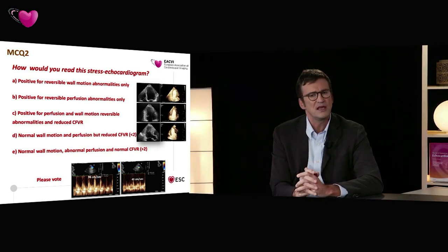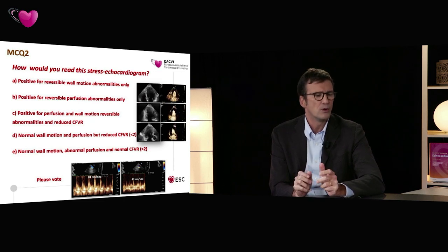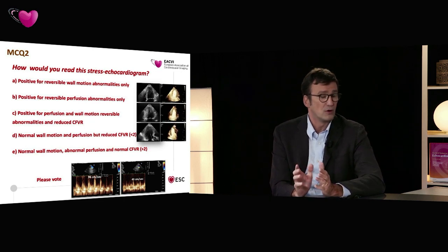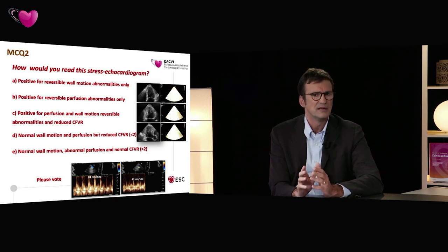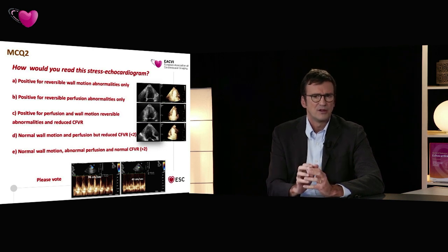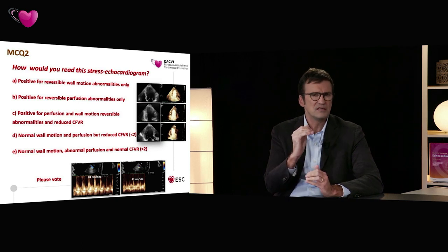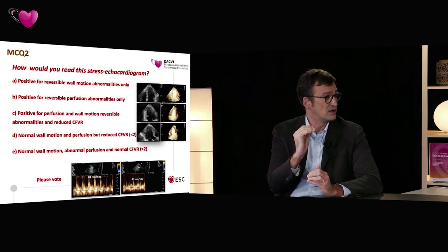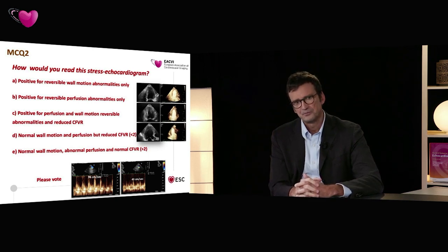Yes, so in this case also, both for color and for Doppler measurement, you should lower your mechanical index down to almost 0 or 0.1, something around there. You obtain very good images for color, they are magnificent, but not for pulsed wave Doppler. So the curve, the TVI, is not perfectly traceable, but you can easily see the peak diastolic velocity, which is the thing you use to put in the equation. Absolutely, absolutely. Right.